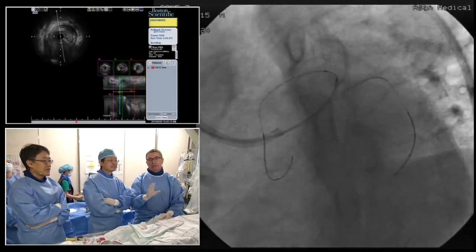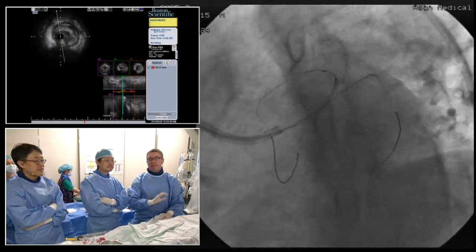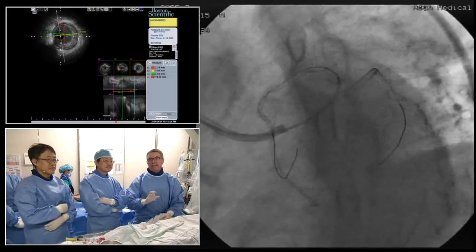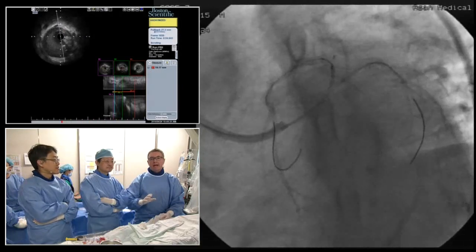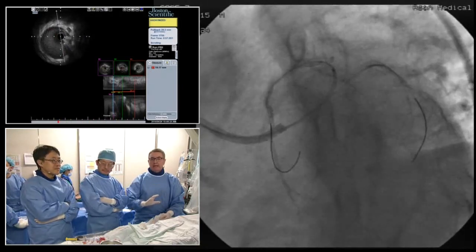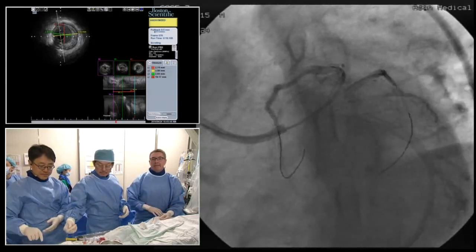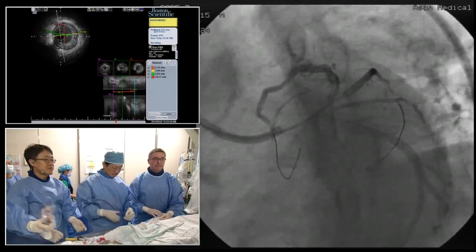So I don't want to create an injury in the LAD at the diagonal end with a very large stent. So it'd be easier to use a compromise technique where we have a decent stent for the LAD beyond the diagonal and for the proximal LAD, and then use a proximal optimization technique for that same stent in the left main. But I think you have to cross over.